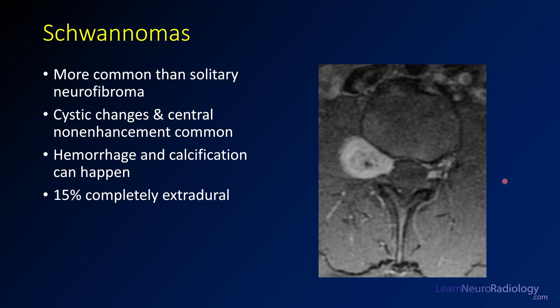Schwannomas are more common than solitary neurofibromas. Cystic changes and central non-enhancement are relatively common. Hemorrhage and calcification can happen but are relatively rare. About 15% of schwannomas are completely extradural — out in the muscle or superficial soft tissue. This is another example of a schwannoma expanding the neural foramen with involvement of the spinal canal and extracanal soft tissues.